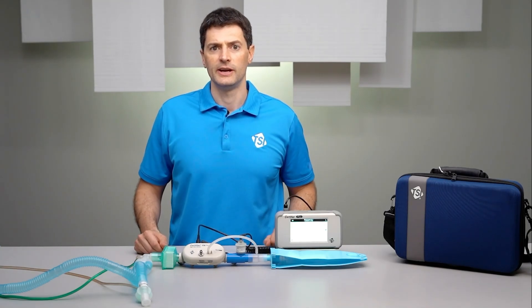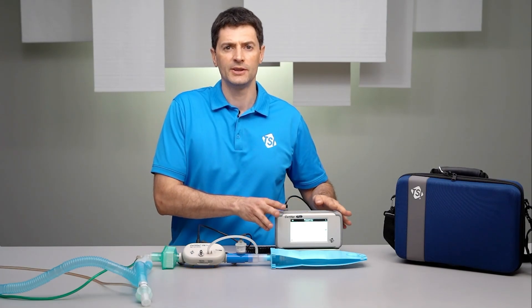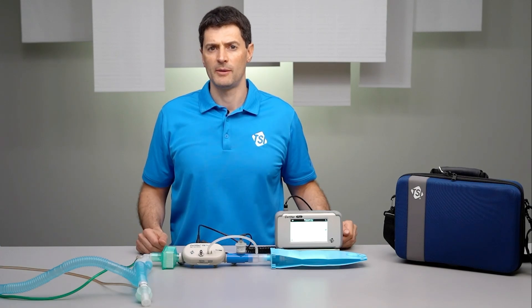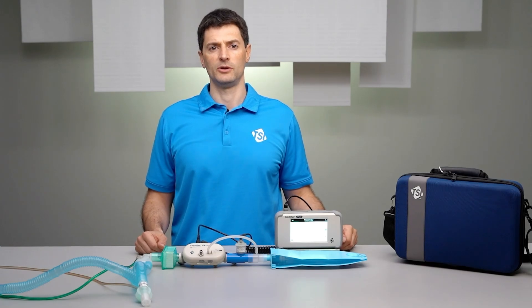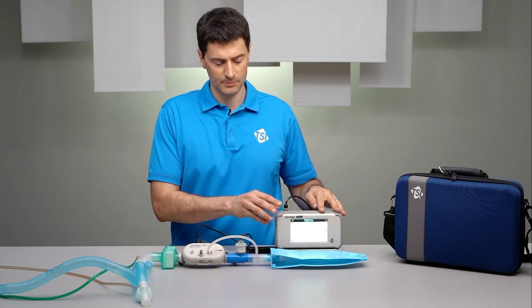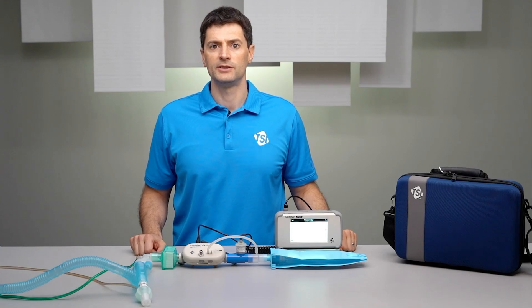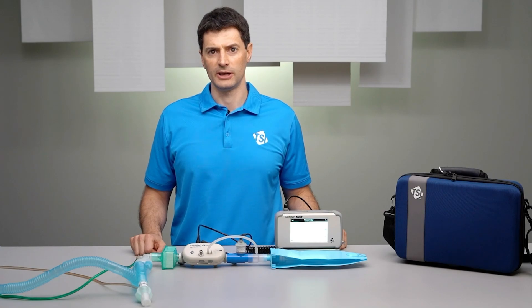After the circuit is set up, you would then configure the test parameters on the Certifier's touchscreen interface. These test parameters are specified by the ventilator manufacturer in their service manual. Learn more about operating the Certifier's touchscreen in other TSI videos. Before you start testing, it's recommended to zero the low-pressure transducer to ensure the most accurate readings.